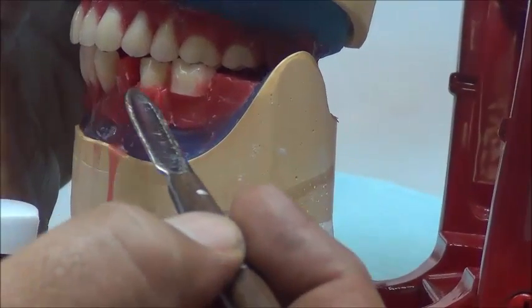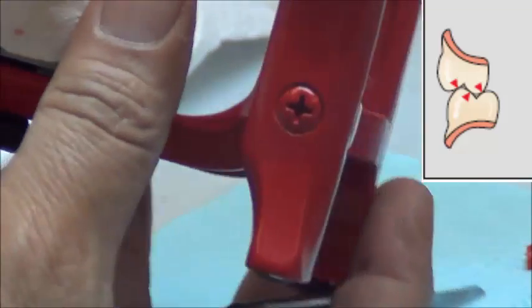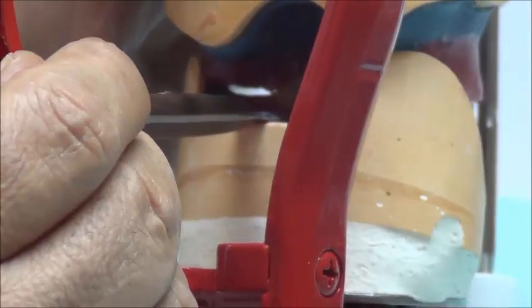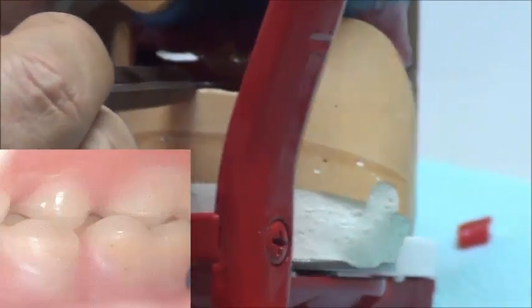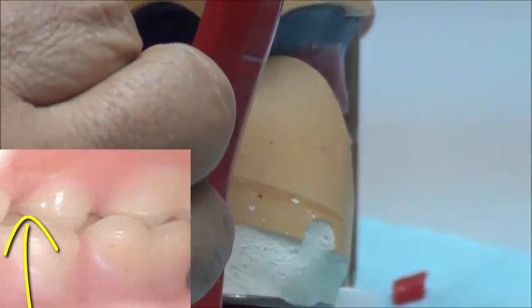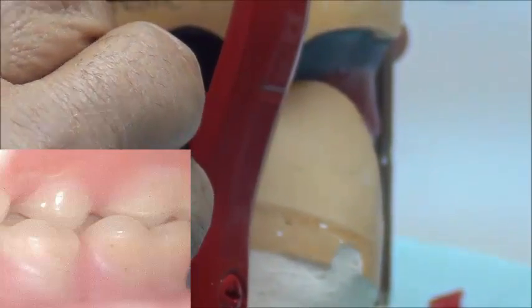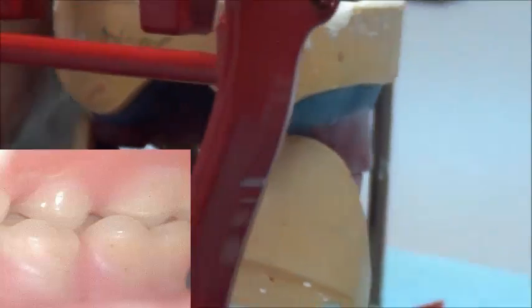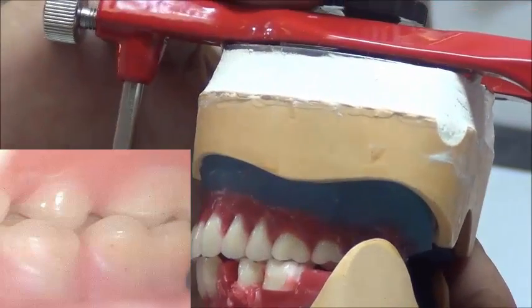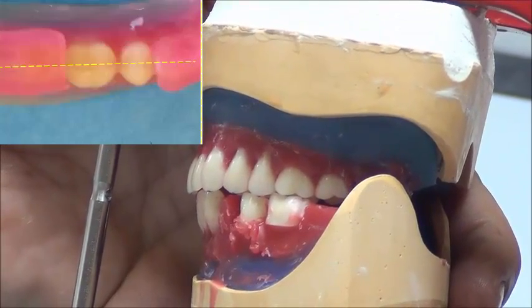We're trying to orient it, raise it to increase the interdigitation with the upper, tilt it from the buccal, and now we're going to tilt it from the lingual. The same as we did with tooth number 6. We're trying to raise the cusp of the lower 5 from the inside to embrace the upper cusp. So the interdigitation of both cusps is now best, and the orientation of the root is correct. Now tooth number 4.